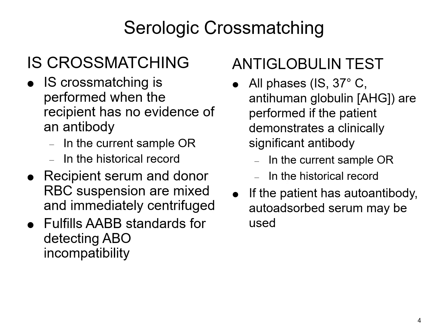So remember, if you're transfusing a unit of red blood cells to a patient, you're actually testing a bit of that segment, and I'll show you a picture of that at some point, where you have those segments attached to that unit. You're going to take one of those segments off and make a suspension, and then that's going to mix with the recipient's plasma. So you're going to put that in the tube: drops of the recipient's plasma, and also a drop of the red cell suspension that you make. And you're going to mix it up, centrifuge it, and record those results.